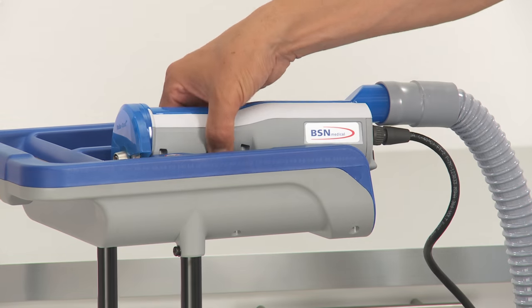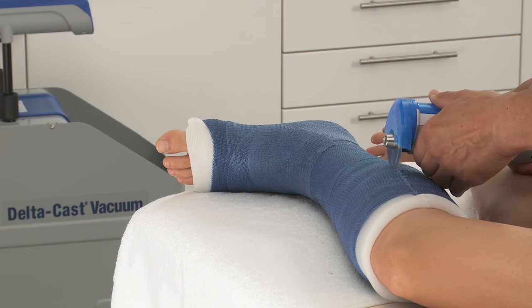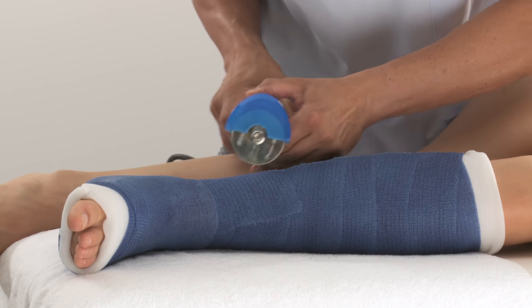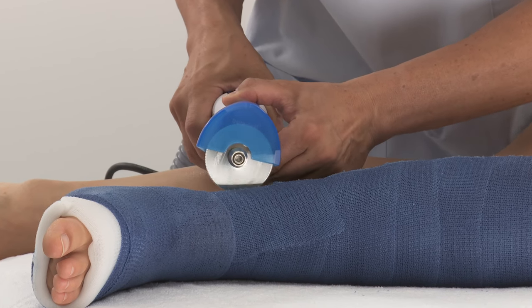Switch on and pick up the cast saw. Carefully begin sawing the cast, starting proximally on the inside of the lower leg. Do a small section at a time, carefully letting the saw blade cut through the cast, but not the padding and stockinette.